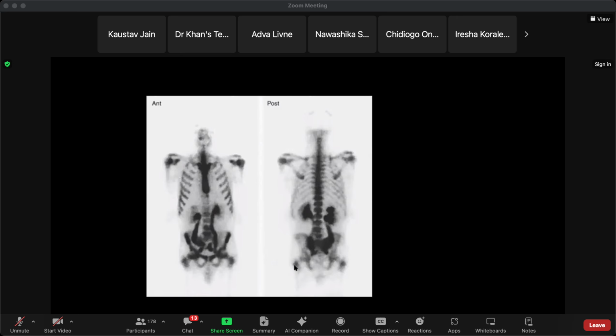So apart from uptake within the ribs, predominantly involving the whole of the sternum and multifocal regions in the pelvis, there is significant uptake actually within the ureters and the renal calyces, which are dilated, also signifying that there is bilateral hydroureteronephrosis, along with bony uptake. Since I can see hydroureteronephrosis, I can be thinking along the lines of some metabolic causes, which involve the kidneys, such as hyperparathyroidism, or again, if there's a primary history, the skeletal uptake could be different to what I'm seeing on the renal uptake.